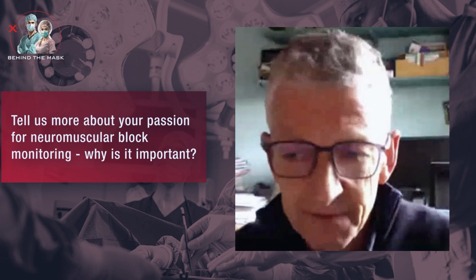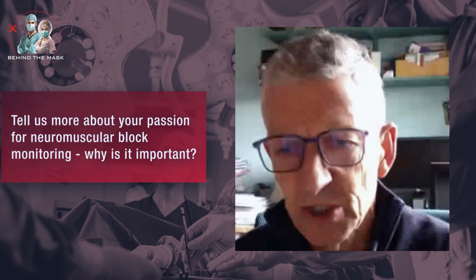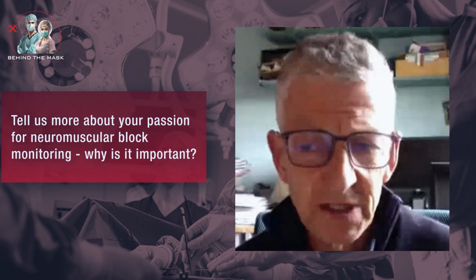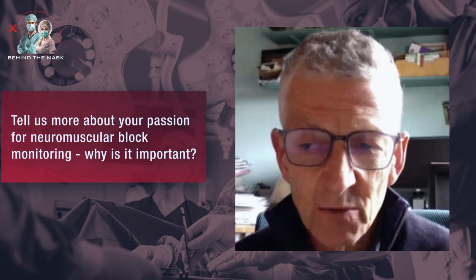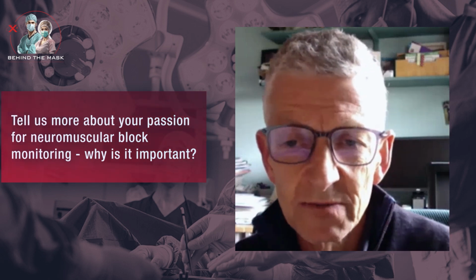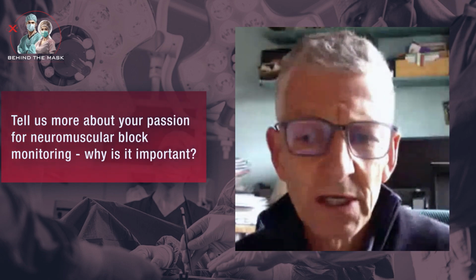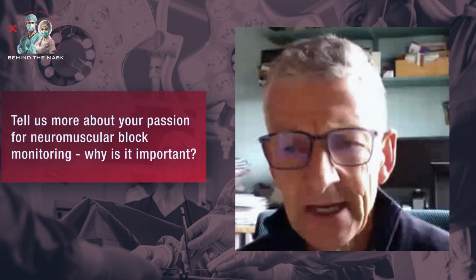I was involved back in 2015 in being part of that working party that established those guidelines, and also in 2021. I had the particular role of collating information and agreeing with my colleagues what we should propose around neuromuscular monitoring. Back in 2015 was the first time the Association of Anaesthetists formally said that neuromuscular monitoring should be used for all patients receiving paralytic drugs through all phases. At that point, we encouraged, or recommended, for departments to move to this type of monitoring.